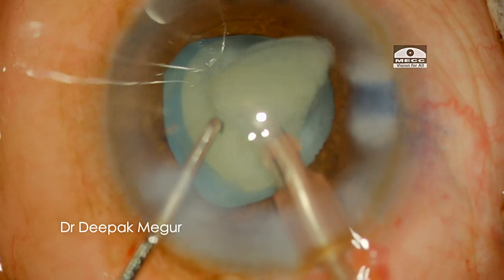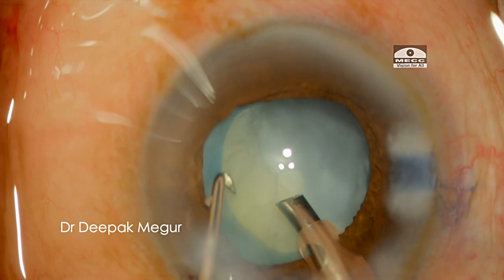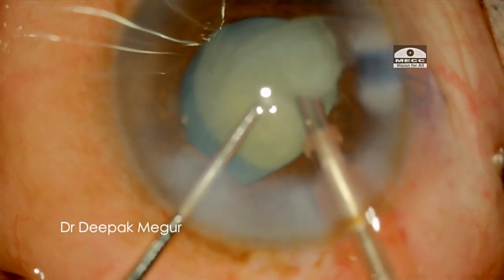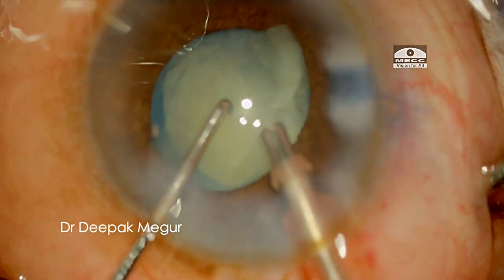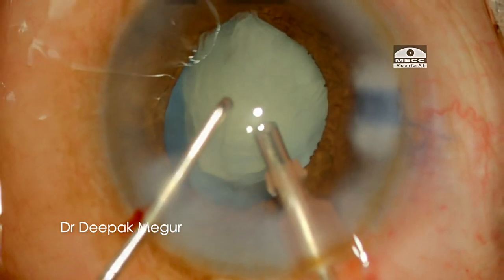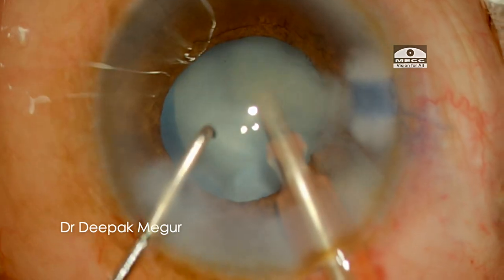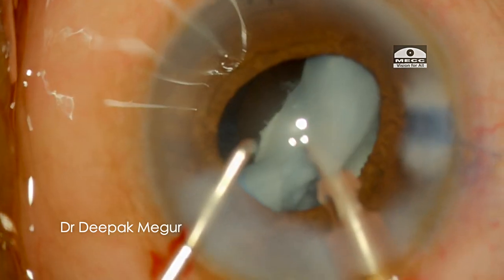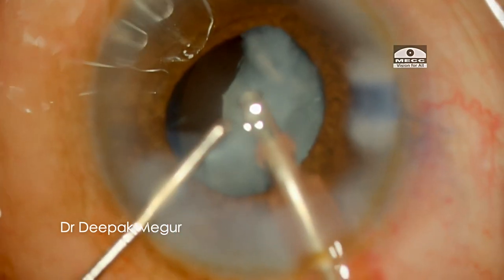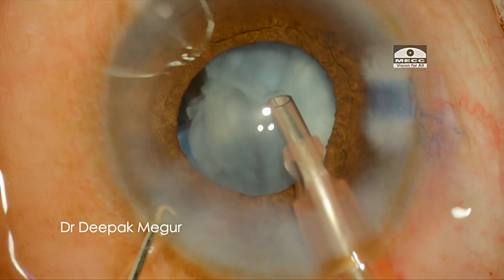After two chops, one fragment is pulled out into the anterior chamber and emulsified. The remaining hemi-nucleus is then gently maneuvered out of the capsular bag into the anterior chamber and emulsified similarly. Contrary to my usual approach of emulsifying in the bag at a more posterior plane, I am emulsifying in the anterior chamber to minimize stress on the capsular bag and prevent any posterior extension of the torn anterior capsule.